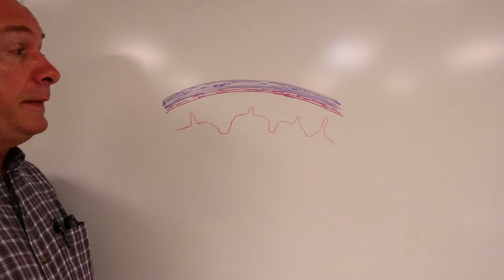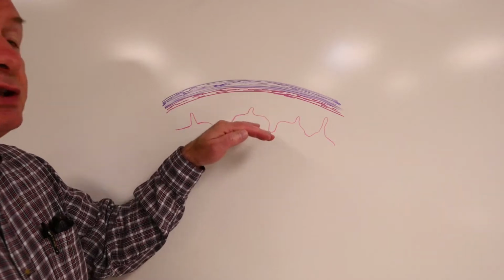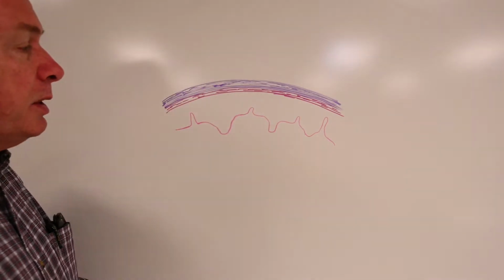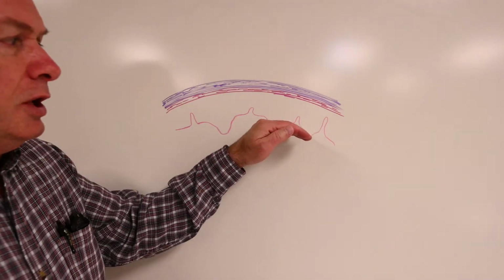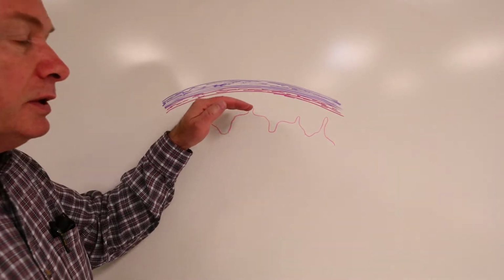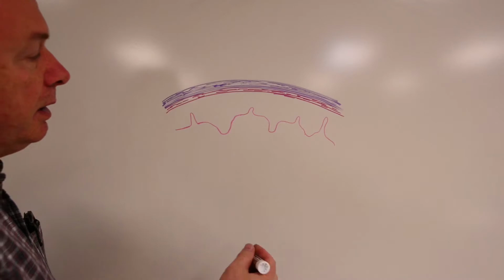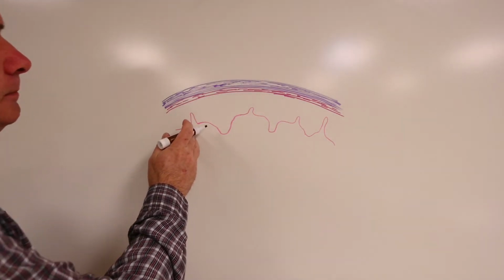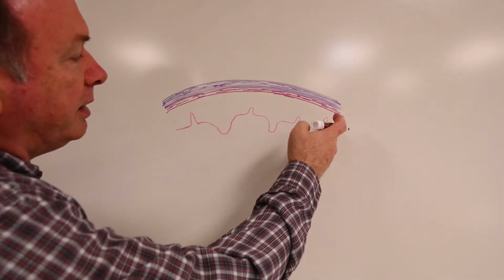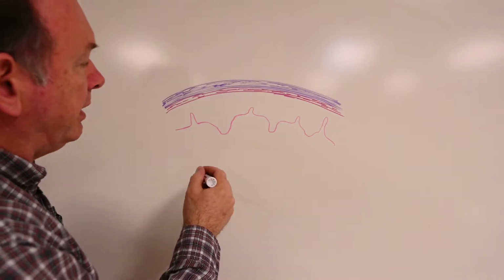Now, when we've talked about the kidney before, we talked about there being a cortex and medulla region in the outer portions and a pelvis in the middle. Where the cortex and medulla come together, we generally say there's a fairly discrete line separating cortex from medulla, but there's a little bit of intergradation, with some inroads of the medulla into the cortex, and some places where the cortex kind of sinks into the medullary region.